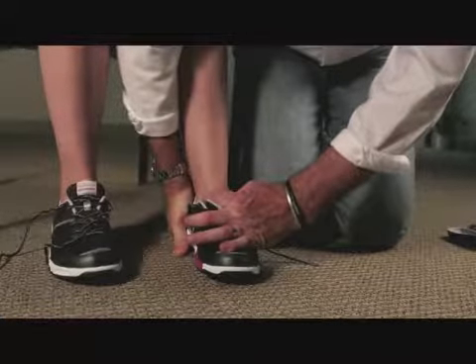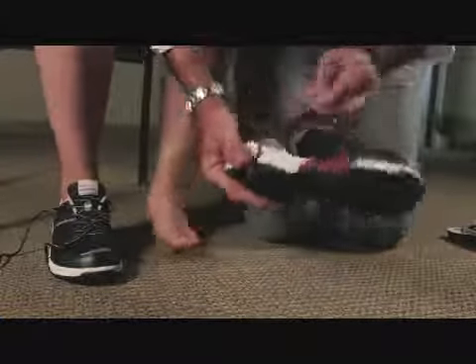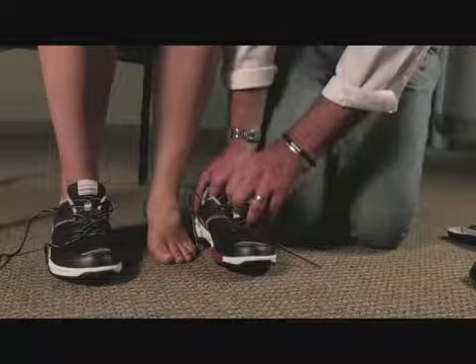Maintaining neutral, when we ask our patient to sit, we take the shoe off, take the orthotic out, let it cool, put this shoe on, and then we do the other foot.